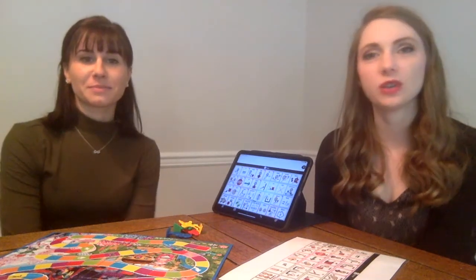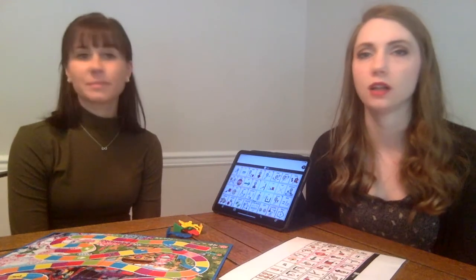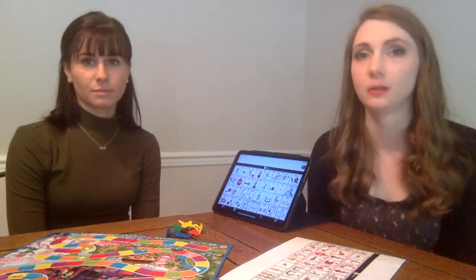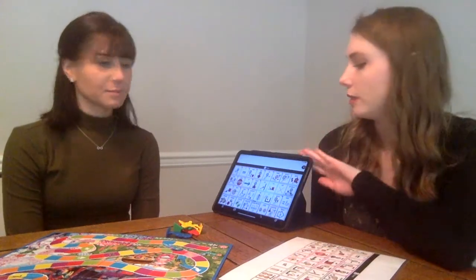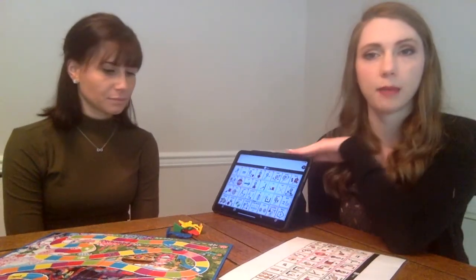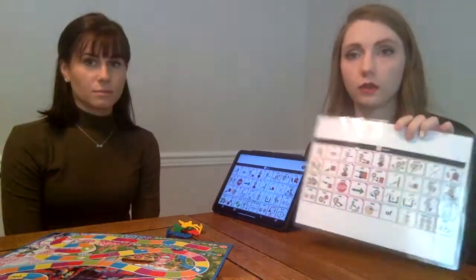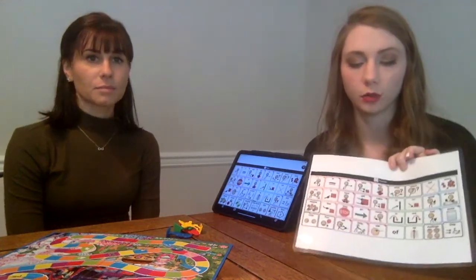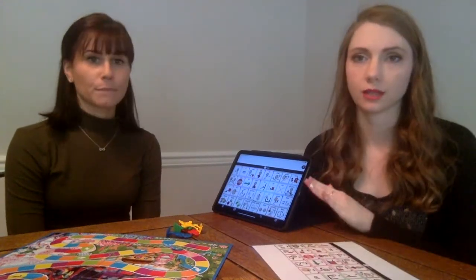Today we're going to be showing you how you can use Proloquo and model the device while you are doing a structured activity with your child at home. So today we have Candyland with us. We have the device, which is an iPad with the Proloquo2go software. And first I'll show you how you can model if you have a communication board, and then we'll show you how you can do it if you just have the device.